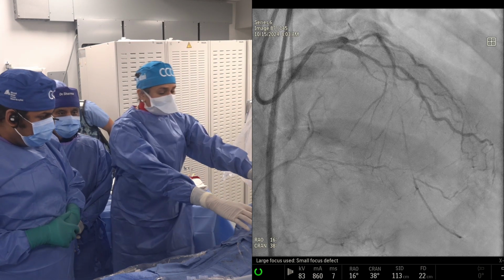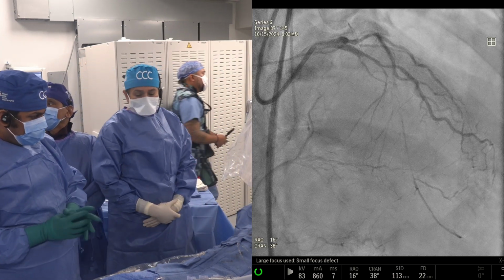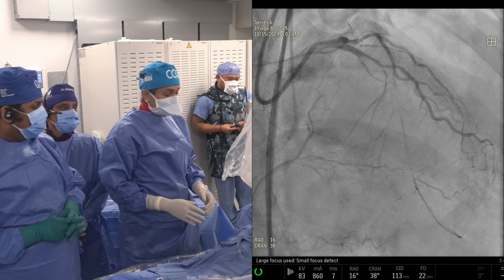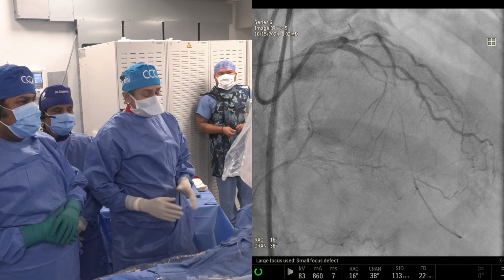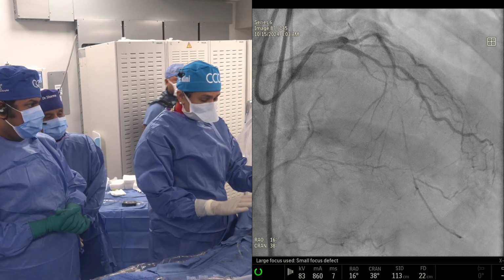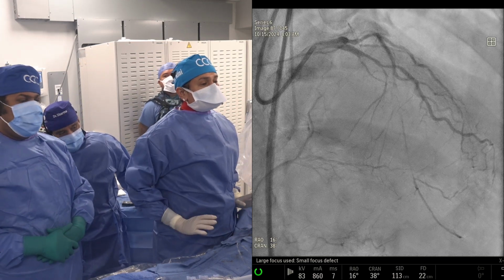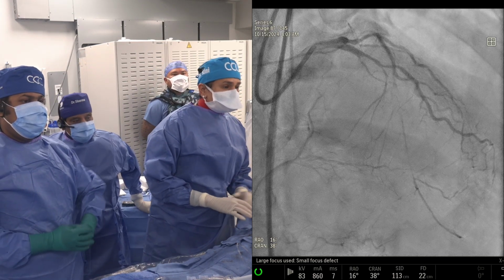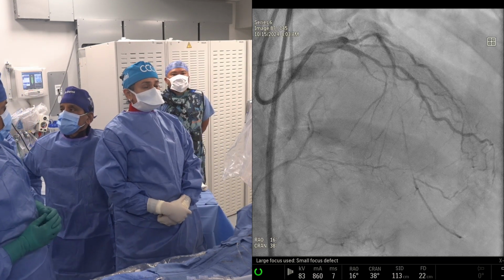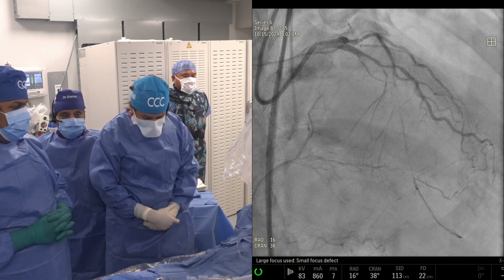You're standing way away. So you also see the ergonomics of the interventional cardiologist. I want to give a lecture one day on ergonomics for the interventional cardiologist, because the musculoskeletal issues are becoming very high among interventional cardiologists. So it's better you stay closer, comfortable, and stand straight, and you are able to do your procedure, rather than having your radial board and staying a little bit further away. If it takes a longer time, you will start having your upper back and lower back issues.